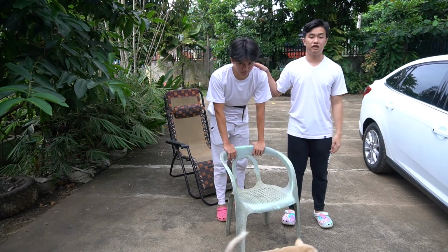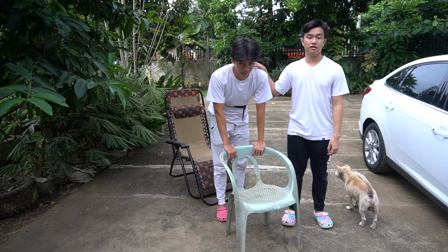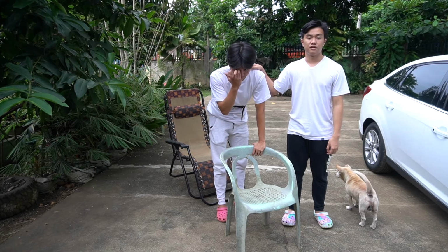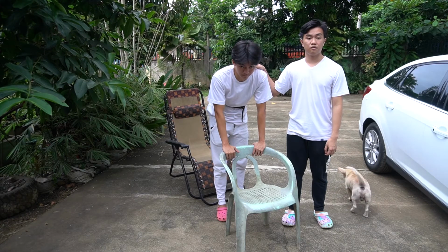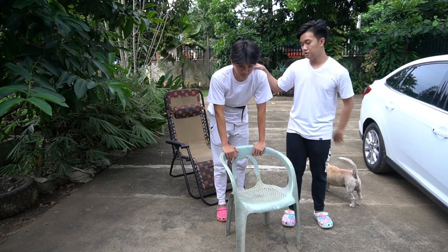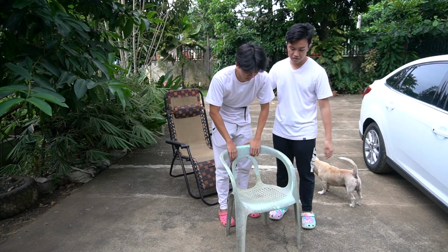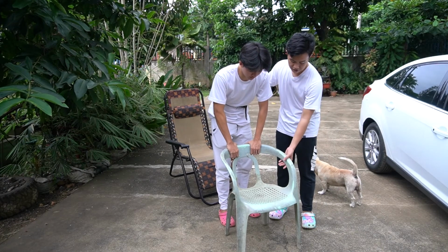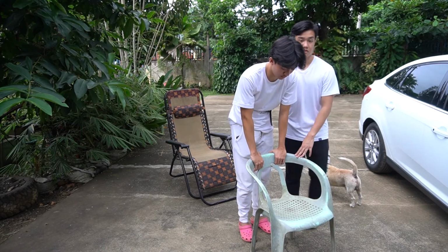After that, have the patient move the walker forward 6 to 8 inches or set it down. Make sure all four feet of the walker stay on the floor. Then tell the patient to step forward with either foot into the walker, supporting him or herself on his or her arms. Follow through with the other leg. So sir, move the walker about 6 to 8 inches. Move, sir. Then follow that up with your feet. Very good, sir.